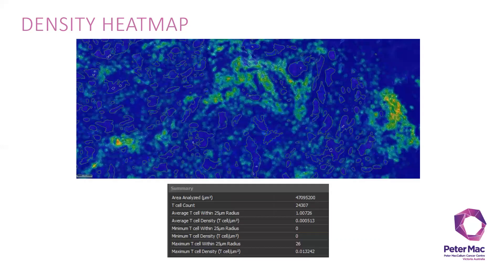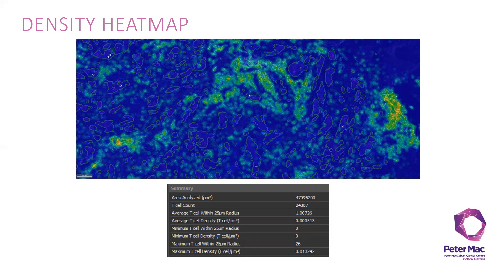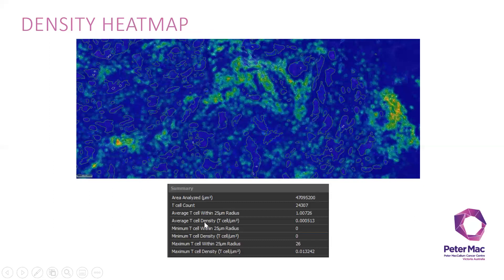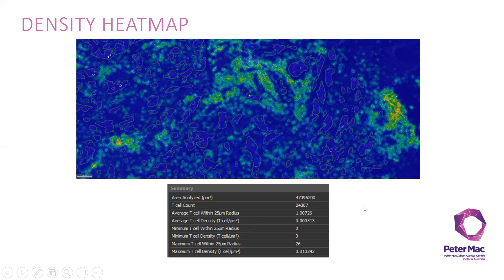From here, you can see it's mostly quite cold. It doesn't have much dense T cell population here. It will show you the average T cells within 25 microns, the T cell density per micron square, and the minimum and maximum number as well.